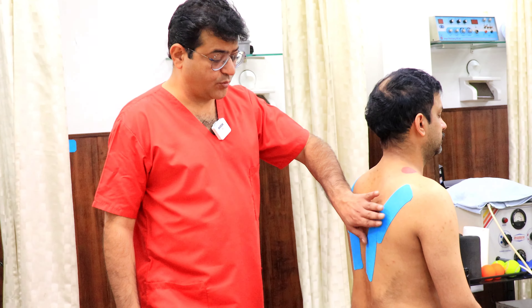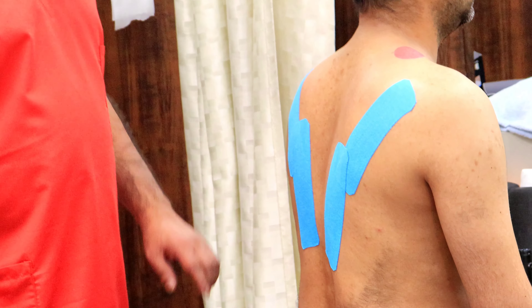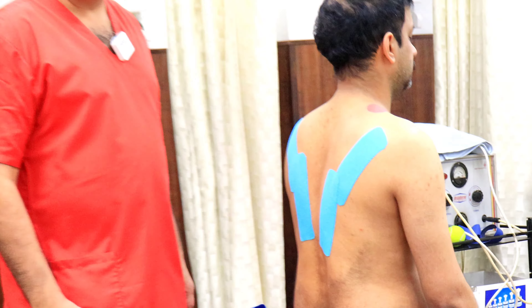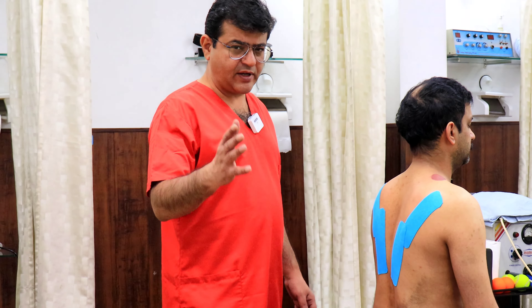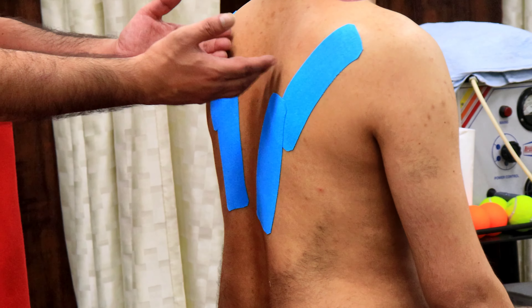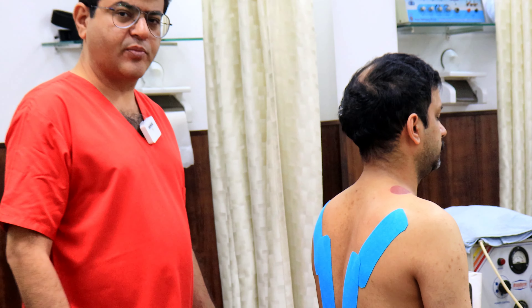This is a sports tape, also called kinesiology tape or KT tape. This taping I have done for the spinning head sensation which a few of my patients get — it's quite helpful. What I have done is supported the lower thoracic and the mid thoracic, which ultimately helps for the neck problem.